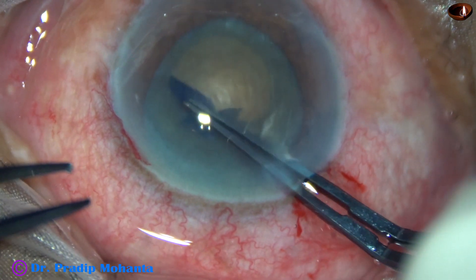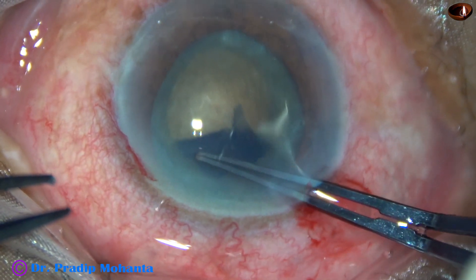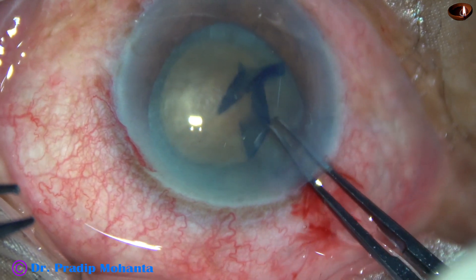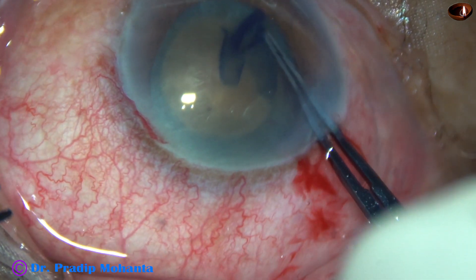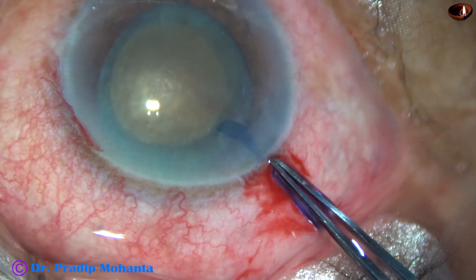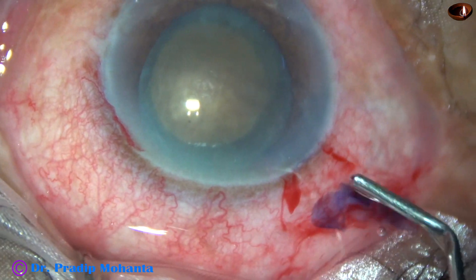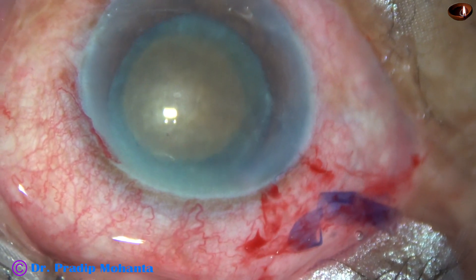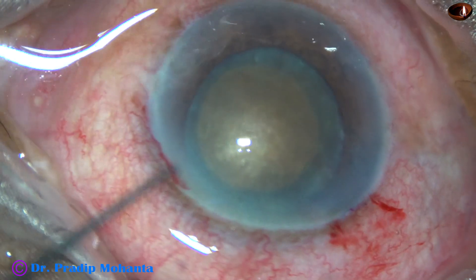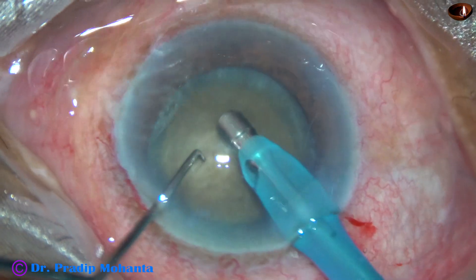The rhexis is about 5.5 or 5.75 mm in diameter. I use the forceps again, and as I am doing this, I can feel and see that the zonule is okay in this case — it is not weak. So I need not use a CTR in this case. But if we use a CTR, there is no harm.